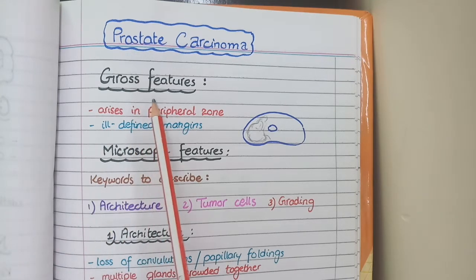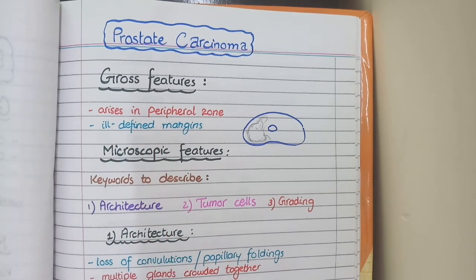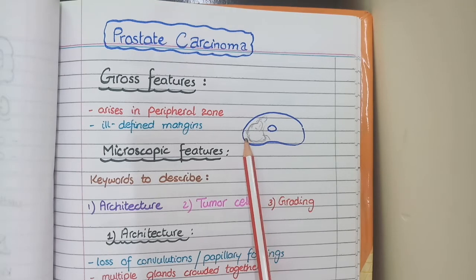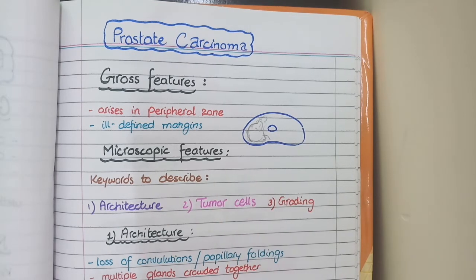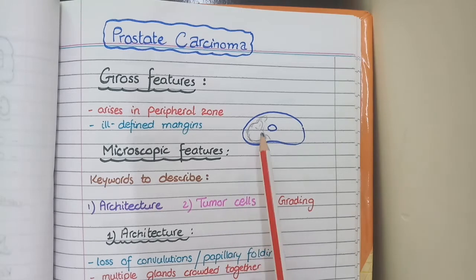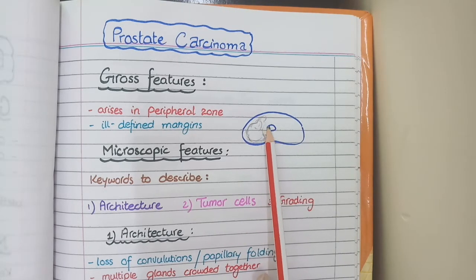Firstly, on the gross specimen of prostate carcinoma, you will see that prostate carcinoma arises from the peripheral zone of prostate. This differentiates prostatic carcinoma from benign prostatic hyperplasia which arises in the central zone, but prostate carcinoma arises in the peripheral zones.